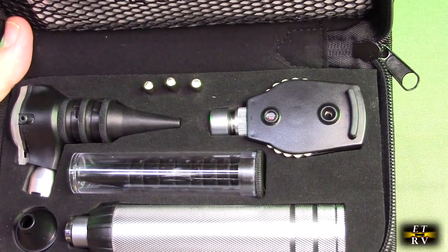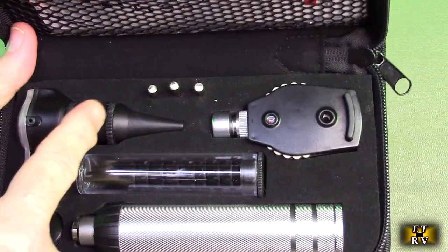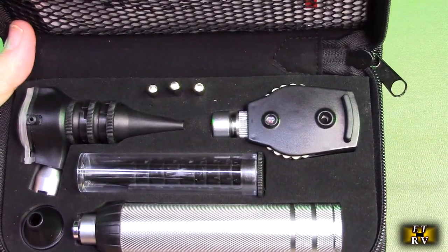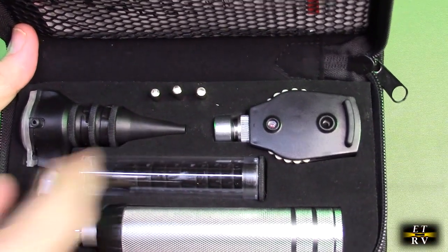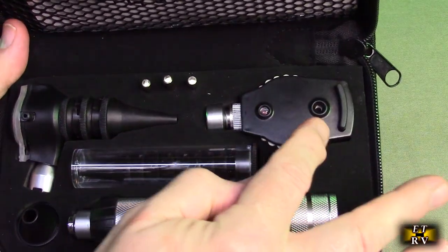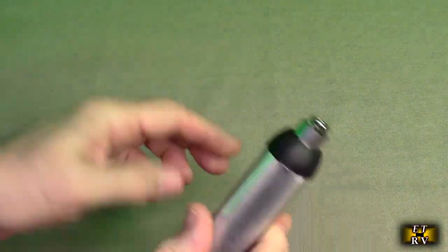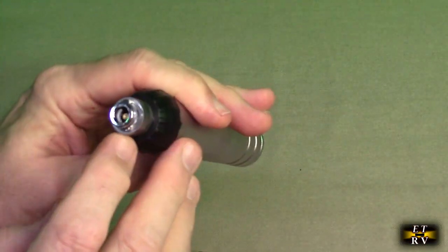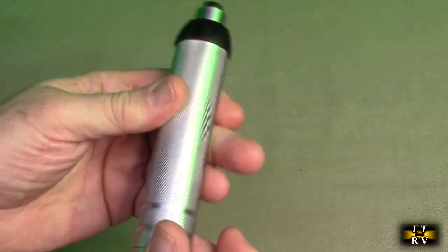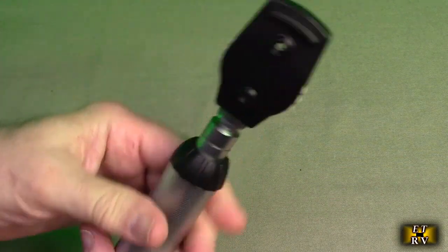The otoscope attachment is for looking into somebody's ears, with different tips. The ophthalmoscope is used for inspection of the retina and other parts of the eyes. Looking at the ophthalmoscope first — this unit has a knurled field to it, with a spring-loaded electrical connection for on/off. You rotate it onto the base and it locks in place just like that.